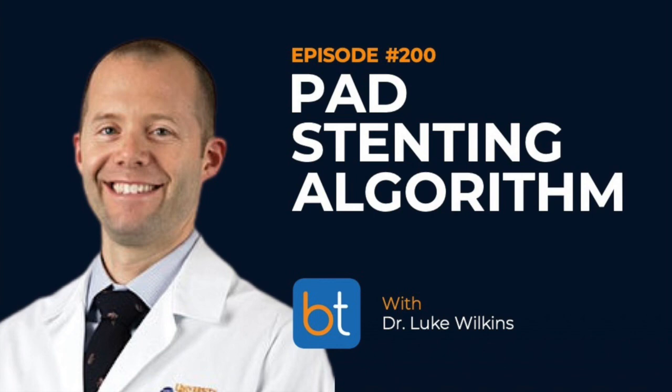Again, with Safari and with going subintimal from the above and from the below, there are many different tricks involved in trying to have those two wires meet within the same subintimal plane at the same location. And it can be frustrating, but there's a lot of nuance involved in that. And we could spend another 2 hours talking about Safari.